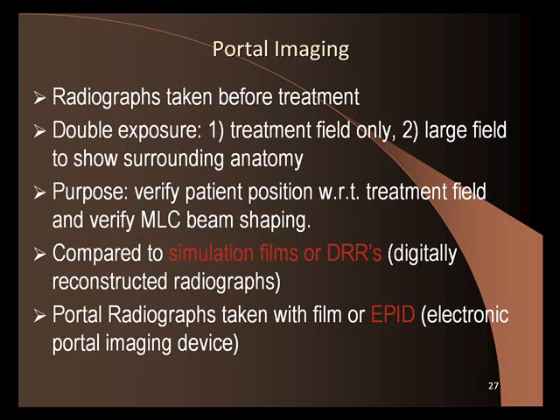Placement of the isocenter with respect to anatomy, and verify the MLC and beam shaping. Make sure the blocks are correct. So that's what the EPID does.